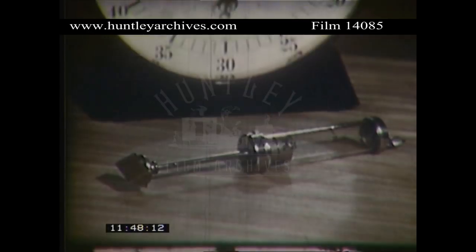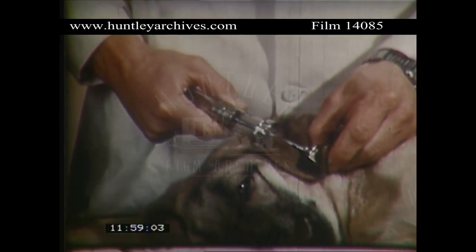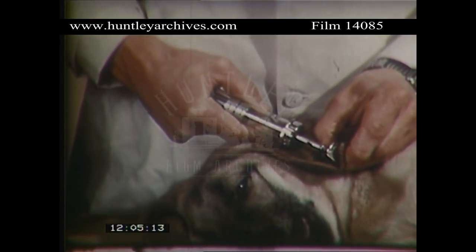To test the pain threshold, a syringe analgesiometer is used. With this, pressure is applied through a brass wedge, and its value calculated from the volume of air compressed in the syringe. There's no response here to a pressure equivalent to about 200 centimeters of mercury, whereas normally this animal would wince at about 90 centimeters pressure.